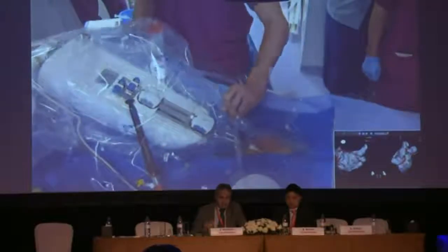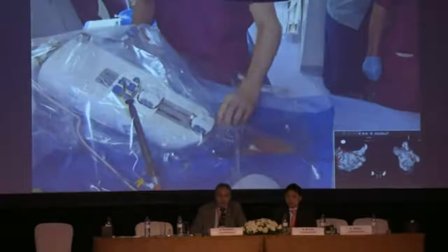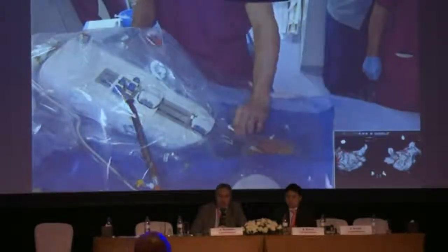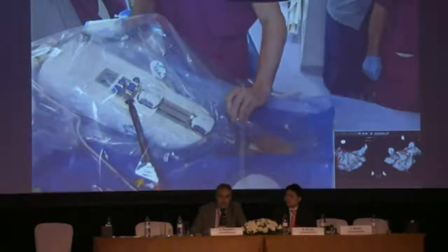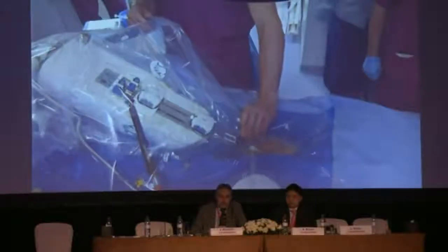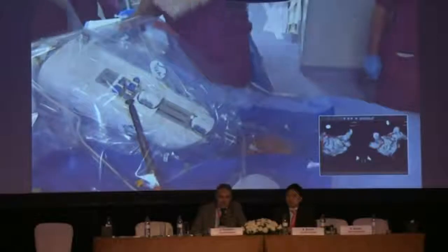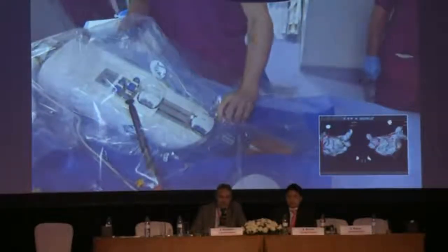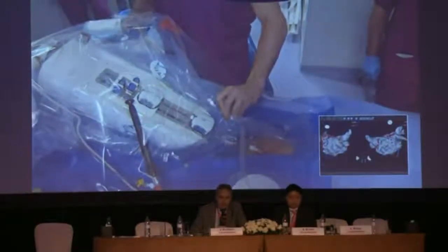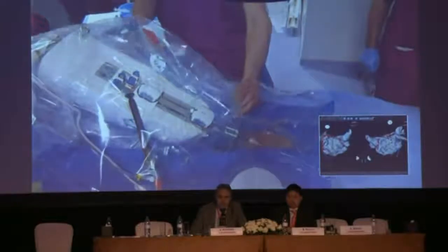Okay, so you can actually use this when there's a certain amount of organization in your atrial fibrillation. And what do you do before that really gets organized? If you're not organized, if it's complete chaos, then I agree. You go to the areas which you know are going to be the culprits, like the ridge between the veins, the septum, and you just have to do a complete map to see where the fastest signals are.